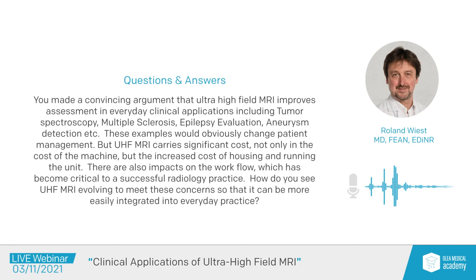I showed this really drastic example of the young boy who received 10 images, and these images, they were either normal or some speculations about hippocampal sclerosis. And you see this so frequently. The patients are sent 2 times or 3 times to the MR with the question, do you now see a hippocampal sclerosis? Because one had initially said it should be one.